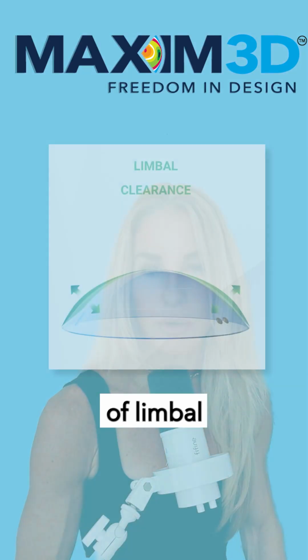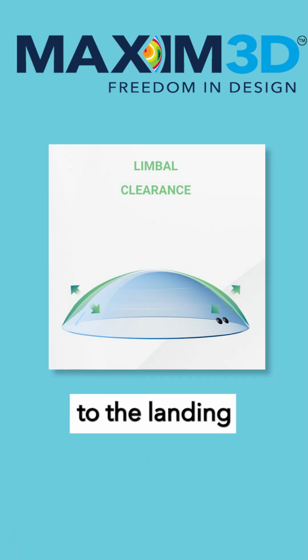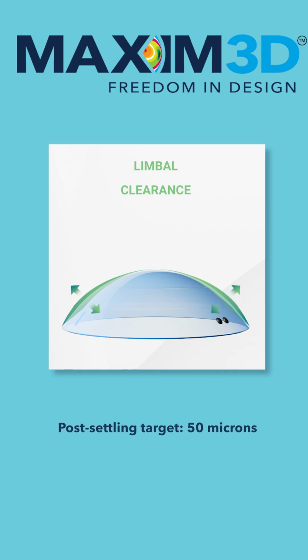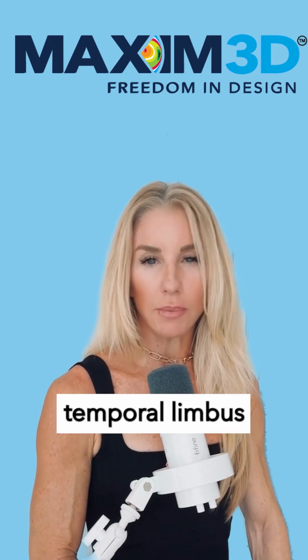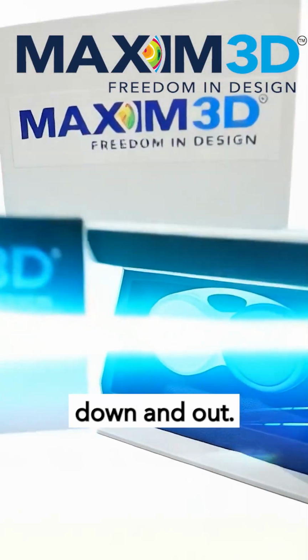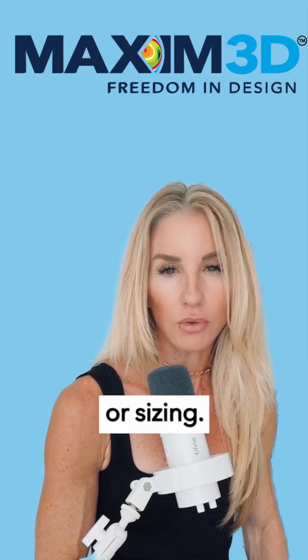Next is assessment of limbal clearance. This zone connects the central vault to the landing and is where a fit often needs the most finesse. Your post-settling target is approximately 50 microns of limbal clearance. Give special attention to the temporal limbus, as Maxim 3D lenses tend to settle slightly down and out. This area is often the first to reveal inadequate vault or sizing.